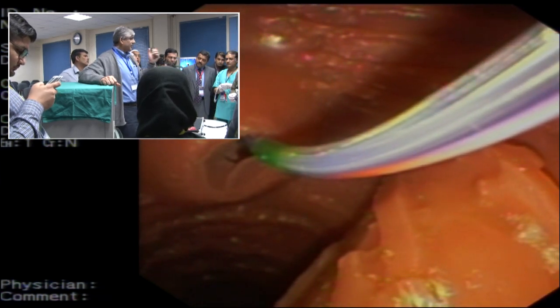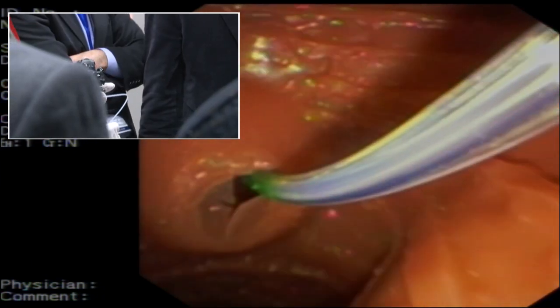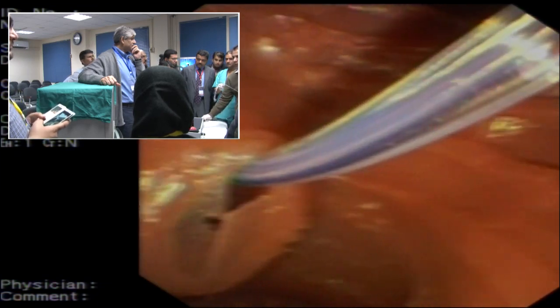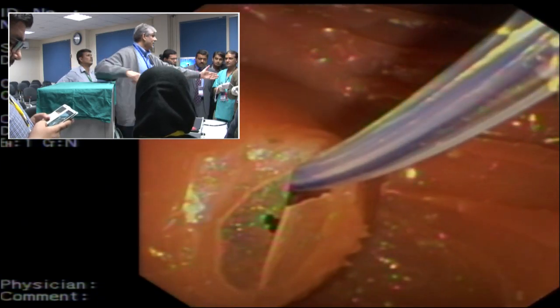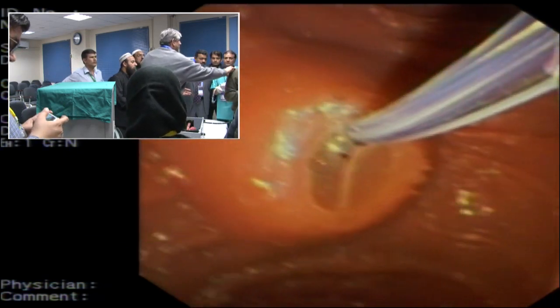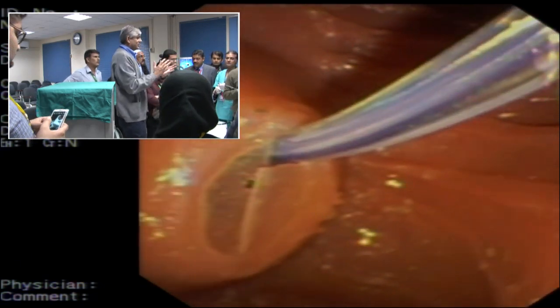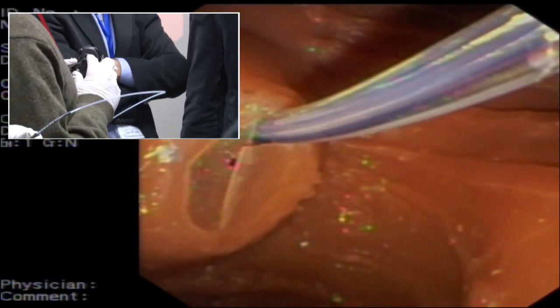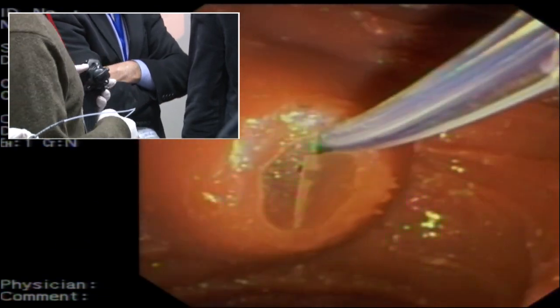Just bring the ampulla again close to yourself. Good. Now I want the ampulla a little bit more centered. What are you going to do? So you did not. All you needed to do was just move one way or the other. Yeah. That's it. So you've got it a little bit more centered. So you understand this movement is actually affecting the ampulla. So you know that the big wheel का ये function है, ये हो गया.